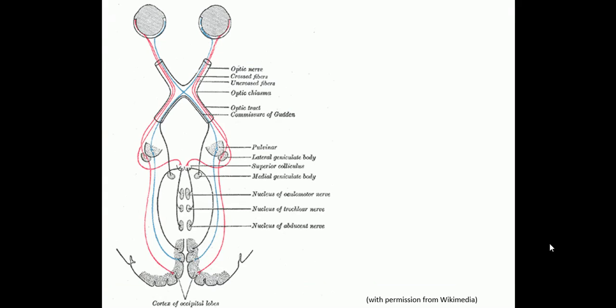So first, we just have to remind ourselves what we're looking for in terms of the anatomy and how we think about the patterns. Here we have a picture of the axial section where we have the eyes and the occipital cortex at the back, and an illustration of the visual pathways that are involved here. I'm going to just overview that in a moment.